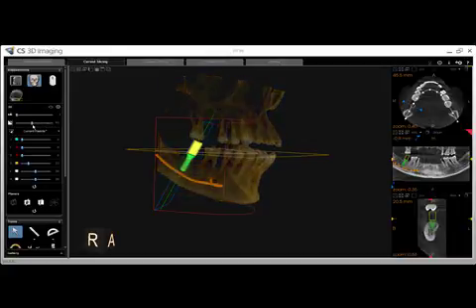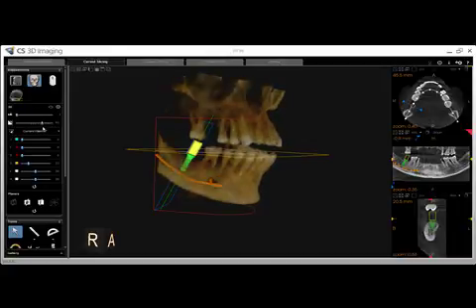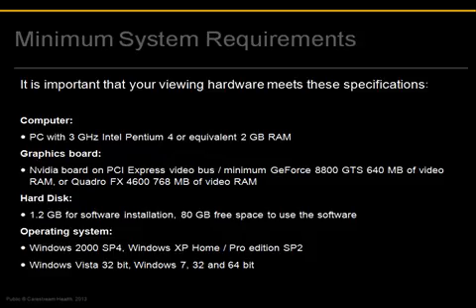You are now prepared to use CS3D imaging basic implant functionality. Please also see our next lesson which covers advanced features and implant library setup. Please take note of the system requirements for best software performance.